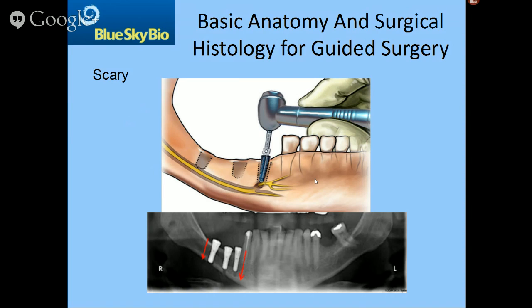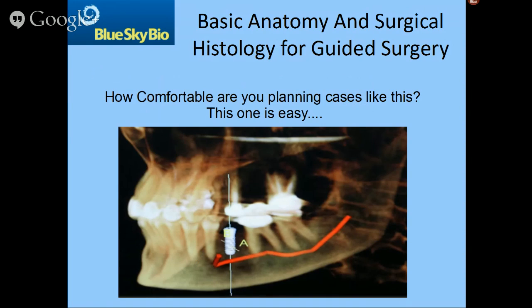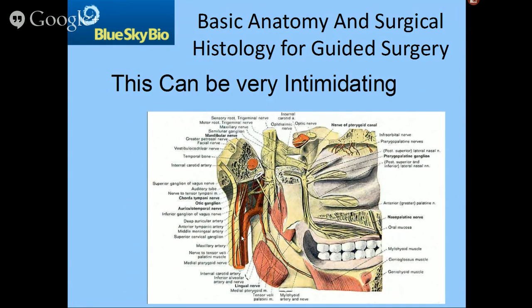So that becomes scary. I've spoken to any number of people who would like to get involved in guided surgery planning, and have all said the same thing. I kind of know it, I'd like to get involved with it, but I am a little averse to the anatomy. It just scares me, and CT scares me, and so on and so forth. So a case like this, for example, should be relatively easy to plan. Yet most dental labs and most clinicians might be concerned about planning these themselves. And that's what we're going to look at. And of course, slides like this scare the living daylights out of people, and they should. There's a lot of anatomy to know if you're going to know anatomy.